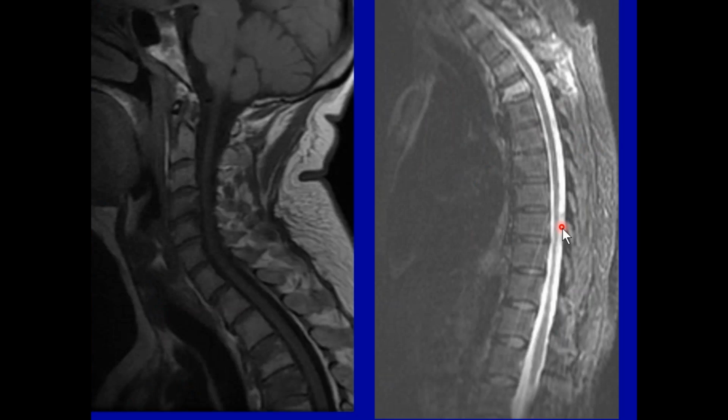And then she went to a local imaging center. They didn't repeat the MRI. They did plain films. And the AP view, which I have, and I just didn't include for a lack of time, turned out well. But the swim lateral, because Eva unfortunately has an increased kyphosis in her upper thoracic segments, didn't turn out very well.